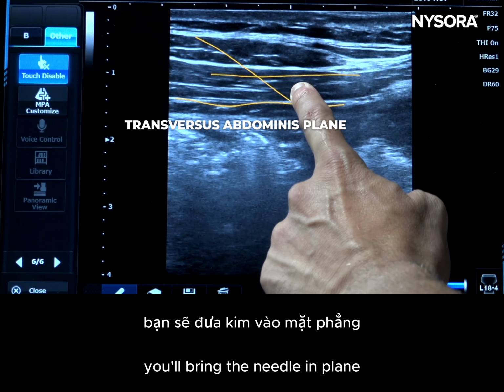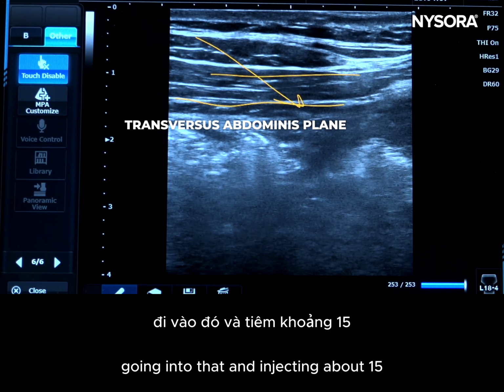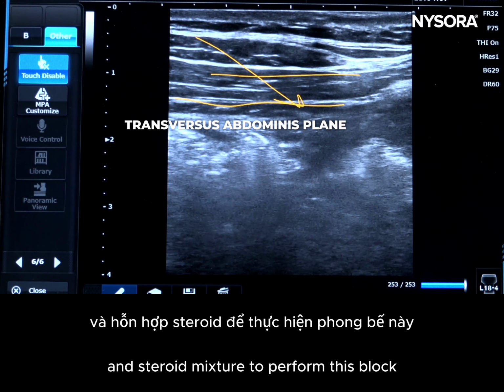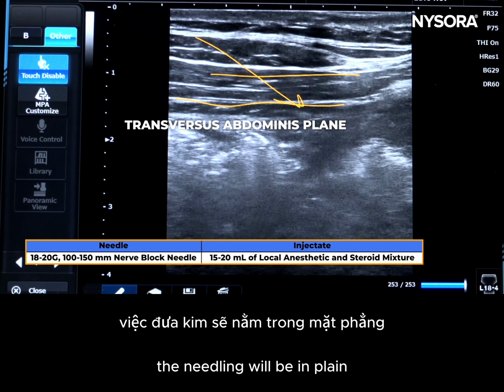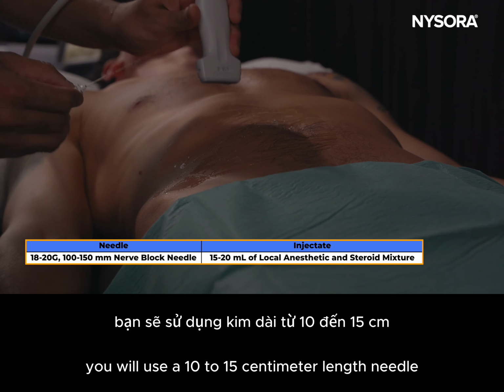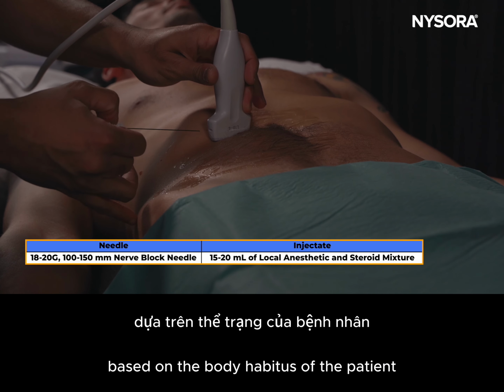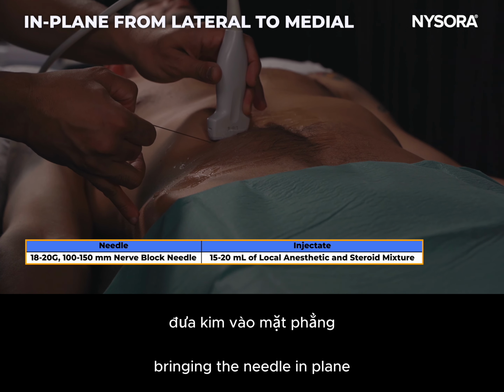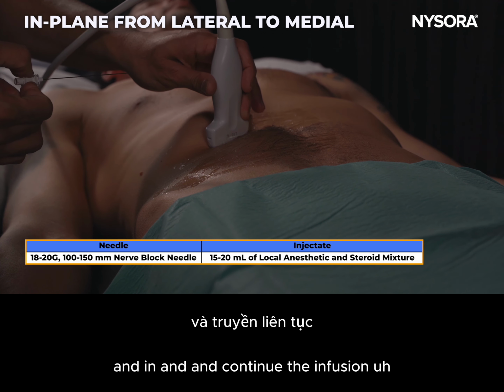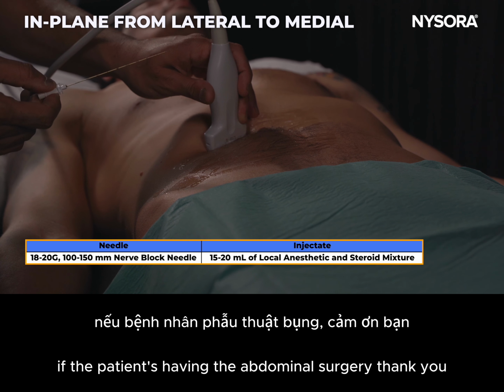You'll bring the needle in plane, going into that and injecting about 15 cc's to 20 cc's of local anesthetic and steroid mixture. To perform this block, the needling will be in plane. You will use a 10 to 15 centimeter length needle based on the body habitus of the patient, bringing the needle in plane. You can also put in a catheter in this plane and continue the infusion if the patient's having the abdominal surgery. Thank you.